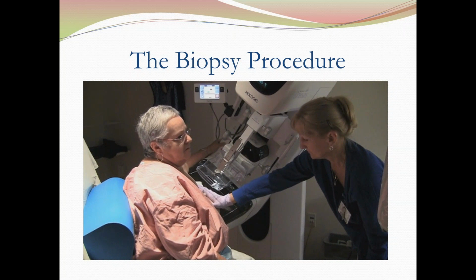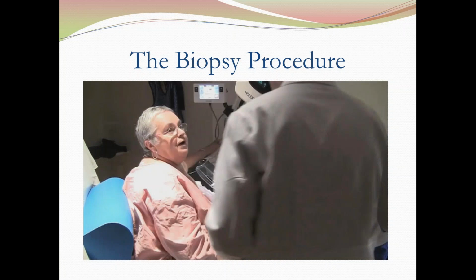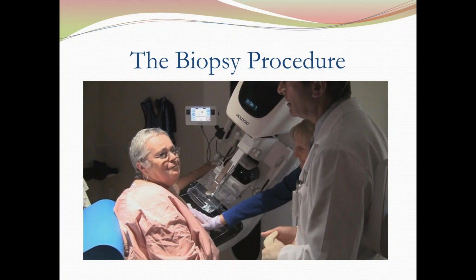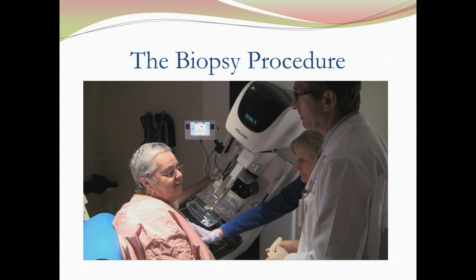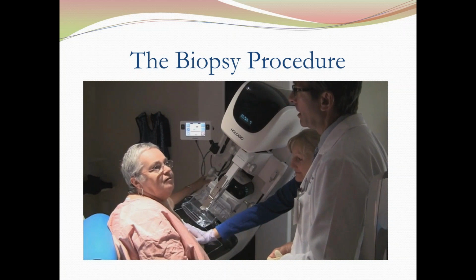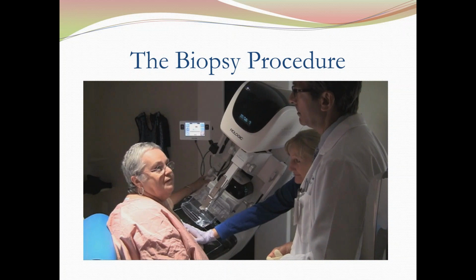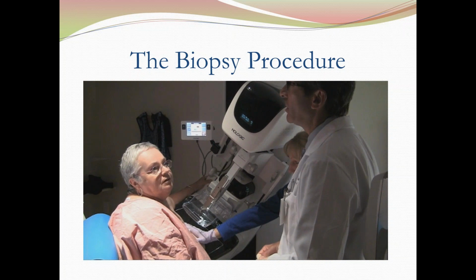The other nice thing is you can see we can do everything in this room, because when I do the post-clip mammogram, I'm going to do it right here with the patient sitting in this room. And you can see she was fine. We did a pain score on her. I think her pain score was like maybe 1. So we were very happy with that.